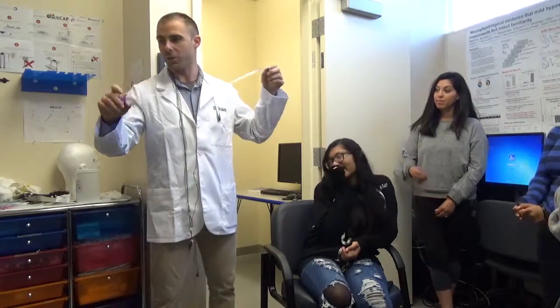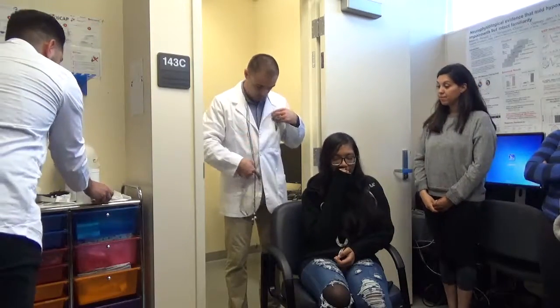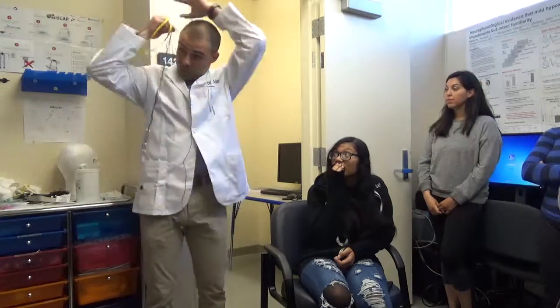Measure her up. So you can actually throw that down there if you want. What we'll do is, notice, by the way, these electrodes have started to creep. That will happen. Be conscientious. Which is why you can do it like I did for a minute or two if you need to set up, but I've been having them here for way too long. It won't be like that in real life, but do be aware because you want to make sure you lean back if that's the case.